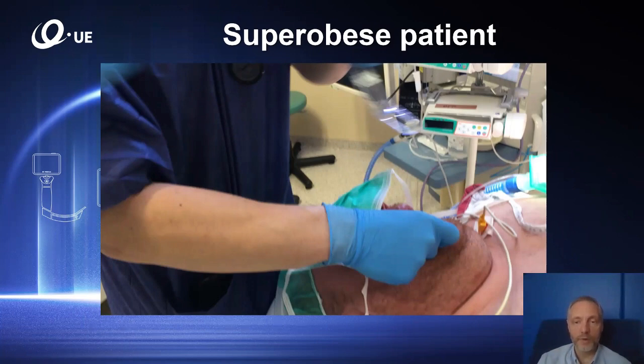Display visualization of the entrance to the larynx was perfect and the intubation was very fast, which, as I said, is very important in patients with high BMI, with a very increased body mass, because of the possible risk of fast desaturation.